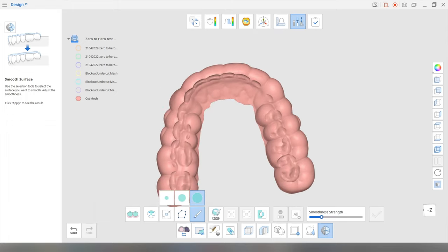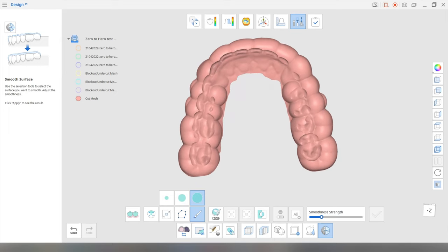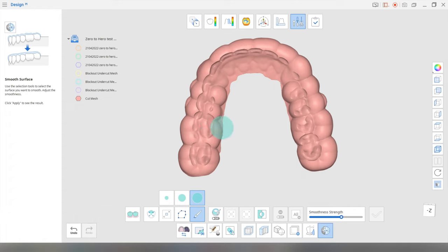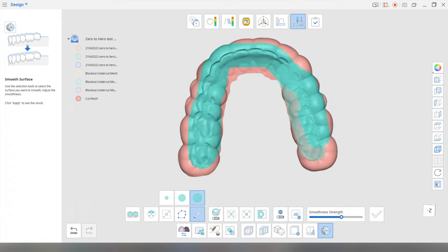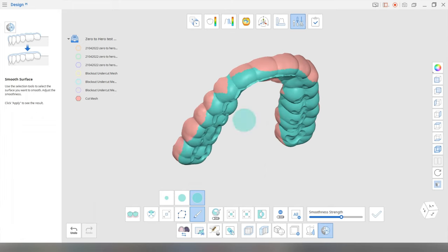So you're just going to rotate and change the viewpoint so that you're just seeing that biting surface. And I would say increase it to a little bit over halfway and then you just paint. Okay. No need to be so precise in this step. You just essentially want to paint over the areas that you want to smoothen off. All right.